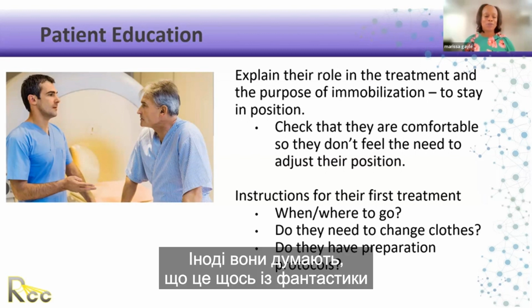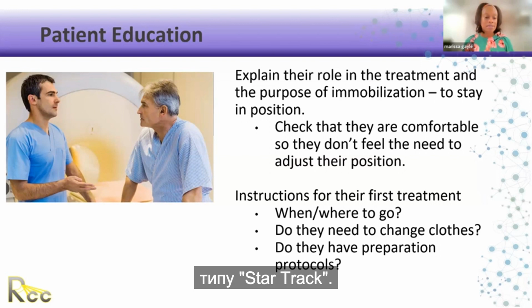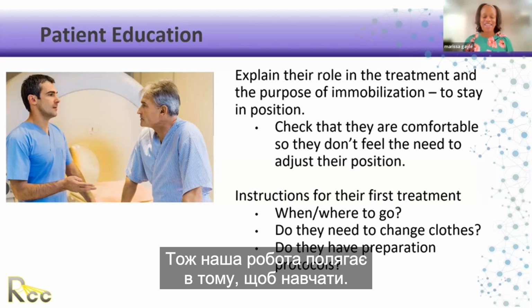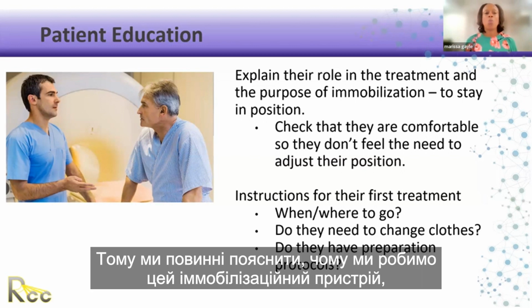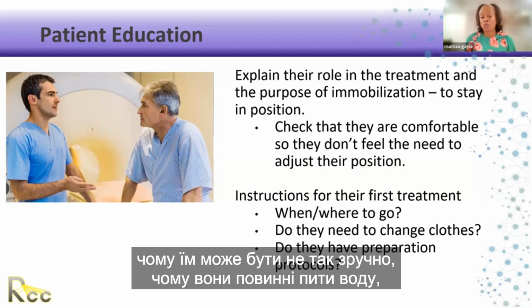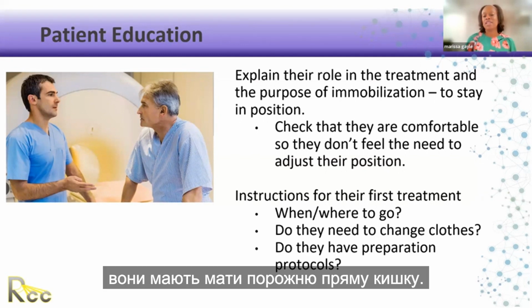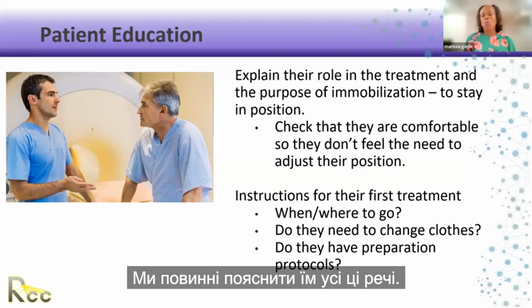They think it's something from like Star Trek, sci-fi sometimes. This is what happens. So our job is to educate. So we have to explain why we're making this immobilization device, why they may not be as comfortable, why they have to drink water to have a full bladder, why when they come in, they may need to have an empty rectum. We have to explain all those things to them.